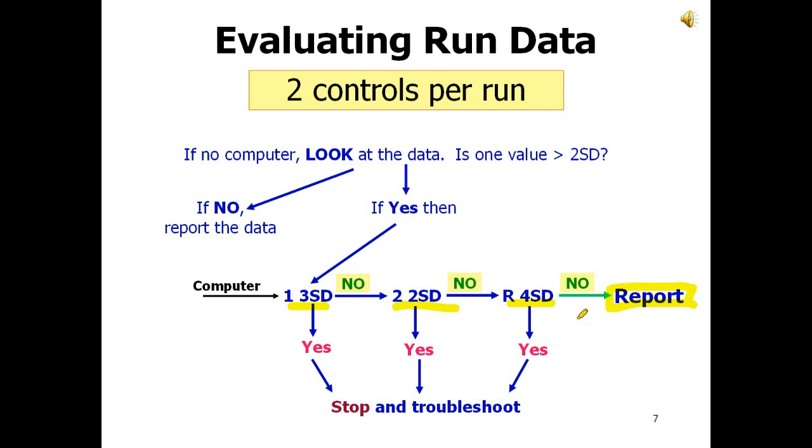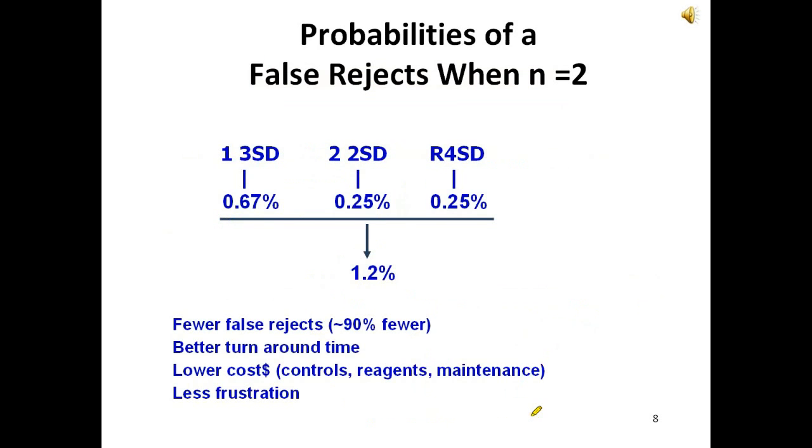So if the answer is not no, then the answer is yes. If you can see that, you stop and troubleshoot. And like I said, we can come back to that later. It certainly does not say rerun the controls. Period. Next slide. I think that's the end. No. This is my favorite part.